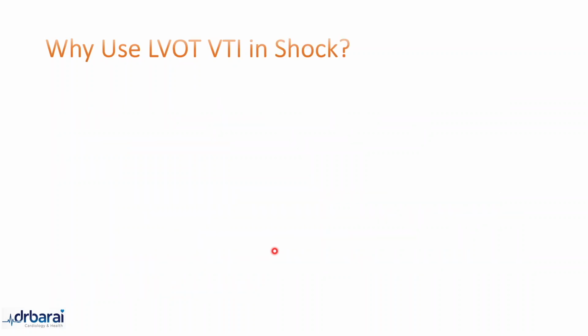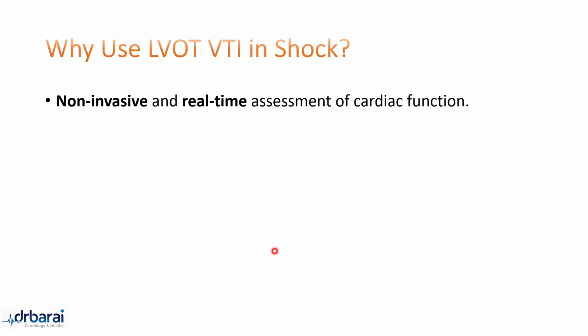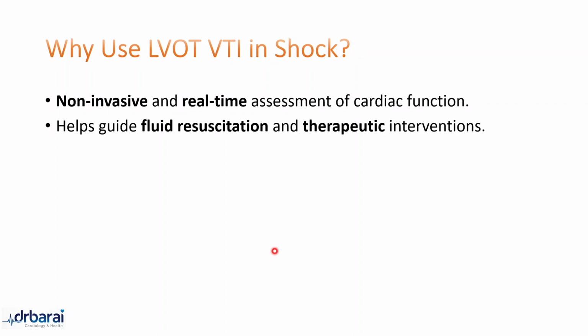Why should we use the LVOT VTI in shock patients? First of all, this is a non-invasive measure. It gives us some real-life, real-time measurements. It helps us to guide the fluid resuscitation and the other therapeutic interventions. A good example is the patient that I have talked about, a patient who has got hypovolemic shock.